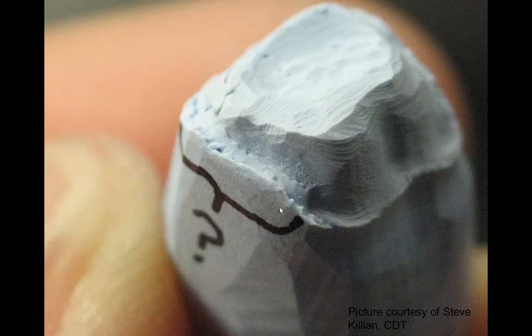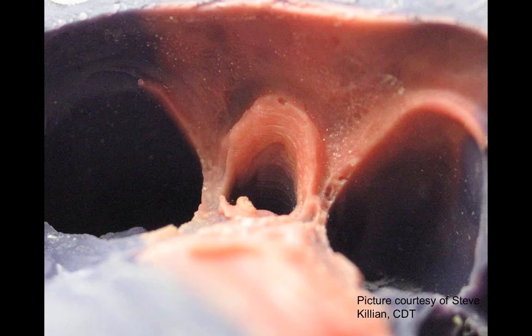Okay. Here's what it looks like when we pour it. Once again, it travels through that hole, and it wound up right here. You've seen this die in a previous one, but it does the same thing. It leaves it all along that interproximal, and you're left to try and invent a margin. And we all know that as good dental technicians, we can invent anything, but it doesn't make it the best dentistry, and that's what we're really after.